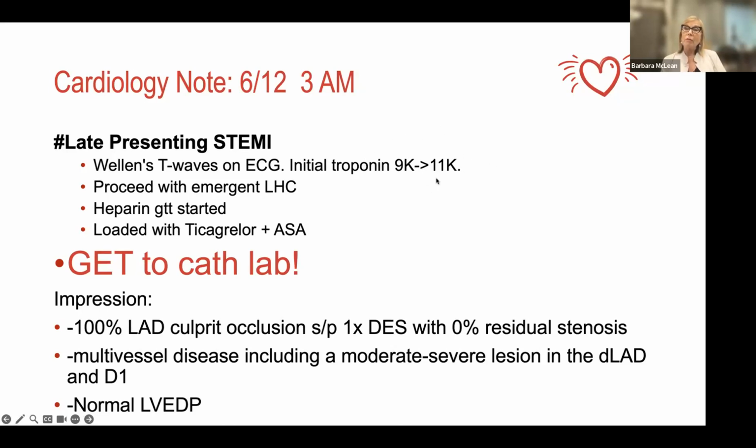I'm very hip to Brugada syndrome. I'm very hip to aVR, the aVR lead ST segment elevation as being an indicator of severe disease and actually life-threatening disorder. I wasn't really familiar with Wellens changes on the EKG. I'm embarrassed to tell you, but look, we're all learning together. How fantastic. And I love cardiology.